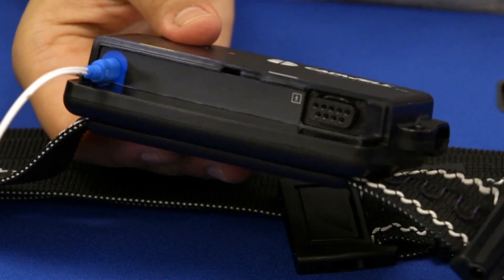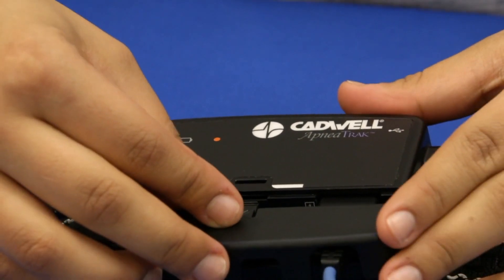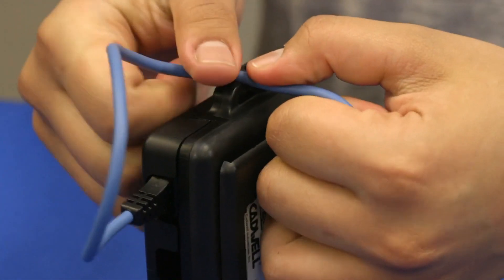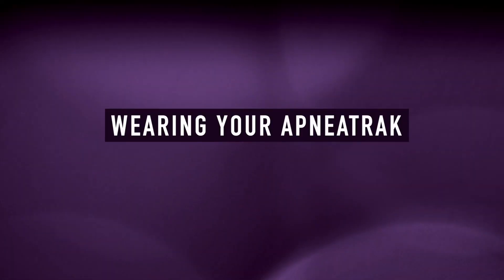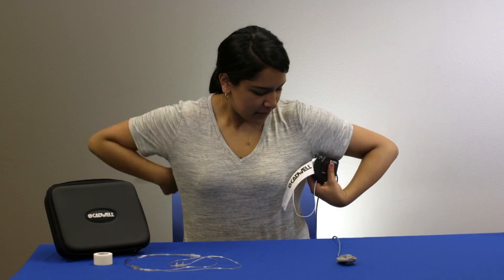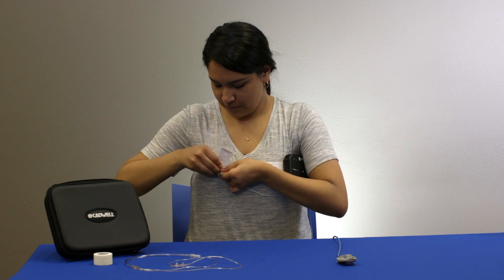Connect the oximeter finger sensor into the black port on the apnea track. Replace the port cover. Press the oximeter cable through the hook on the side of the apnea track. Place the chest belt around your chest and stretch it so the belt is snug and comfortable. Fasten the belt by pulling the hard plastic button through the nearest slot in the belt.